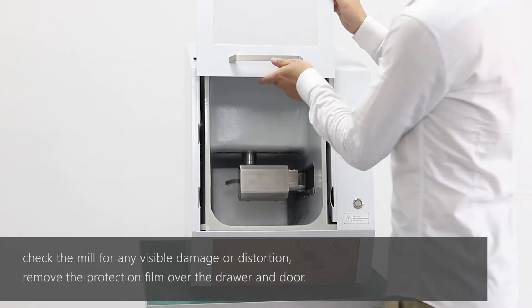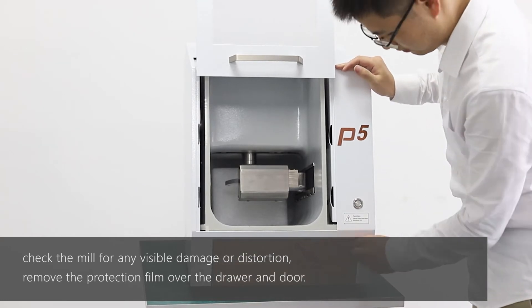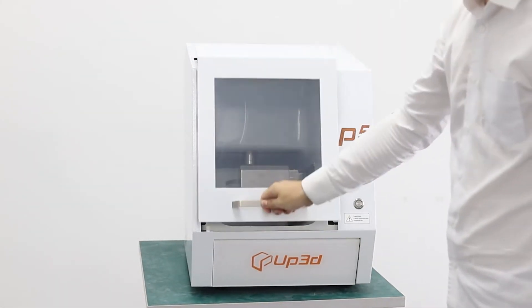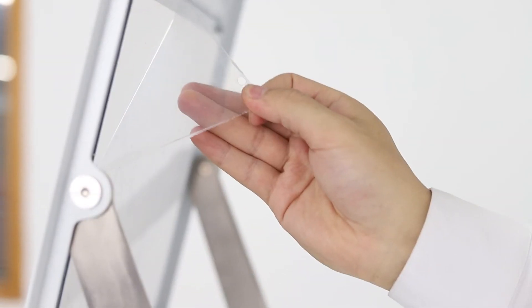Check the mill for any visible damage or distortion. Remove the protection film over the drawer and gate.